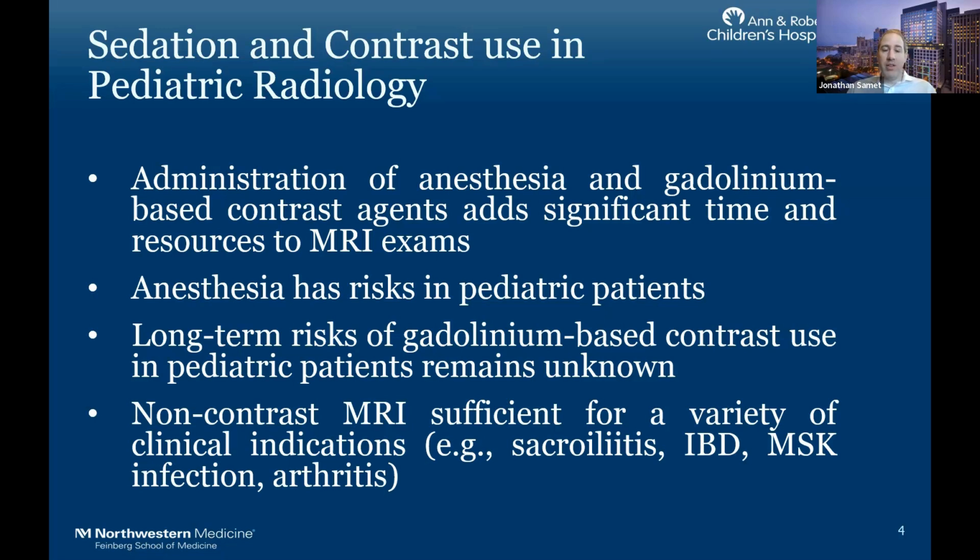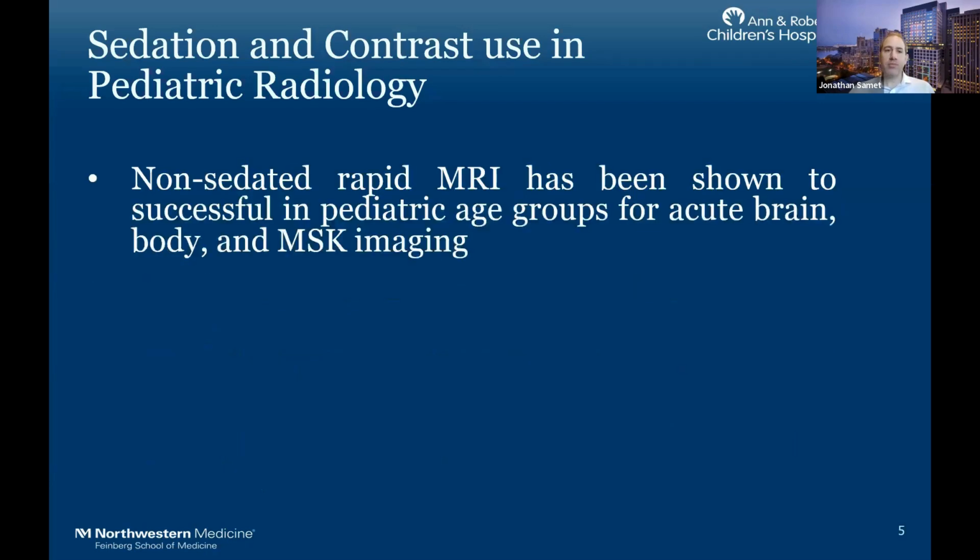So it's not a completely benign thing to just give contrast. As well, there's a growing literature that non-contrast MRI is actually sufficient, good enough, for a variety of clinical indications. You've seen articles on sacroiliitis not needing contrast, some articles on inflammatory bowel disease, and I've written on MSK infection and arthritis even. So there are more and more indications that we know of that don't need contrast. We do MRI for appendicitis without any contrast. So there's a precedent for this.